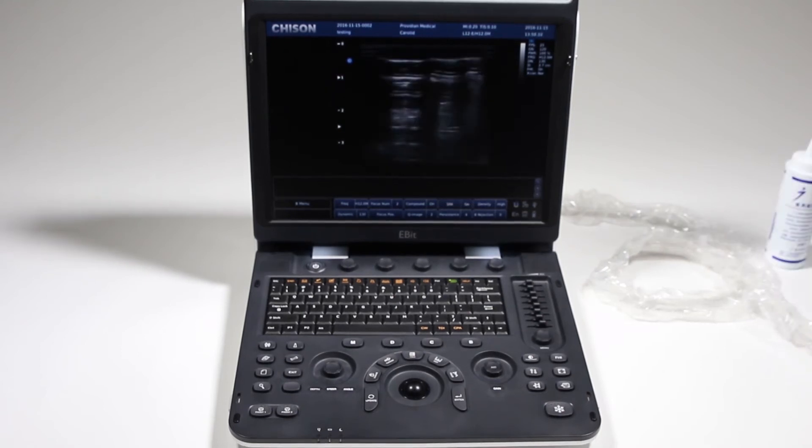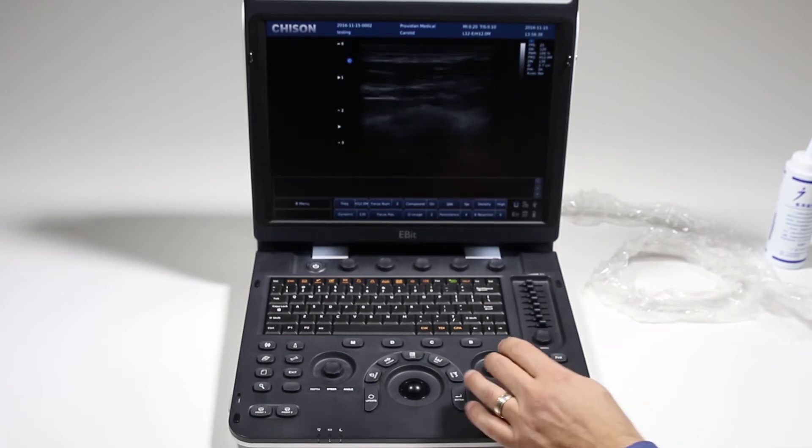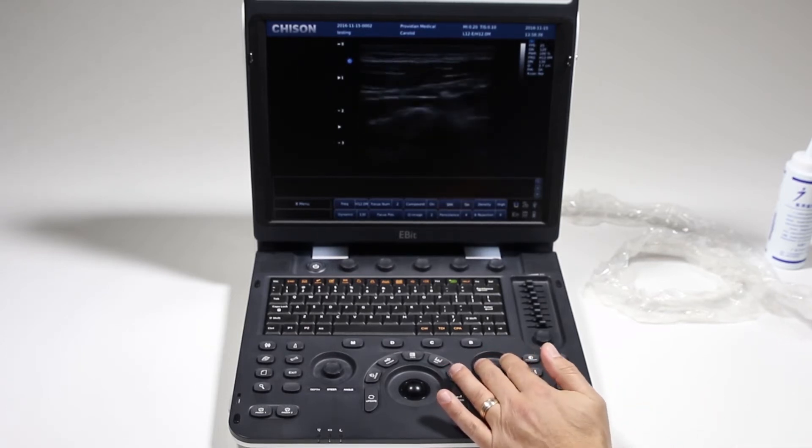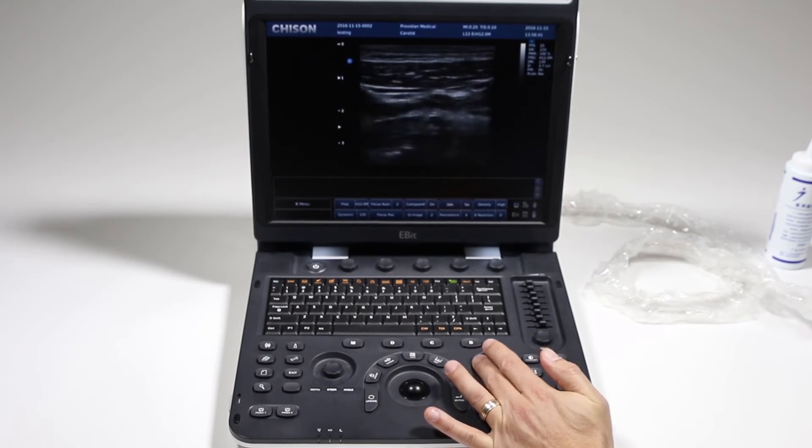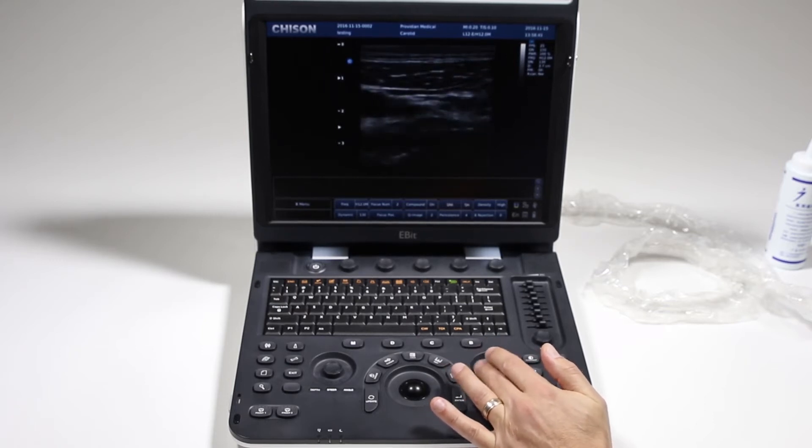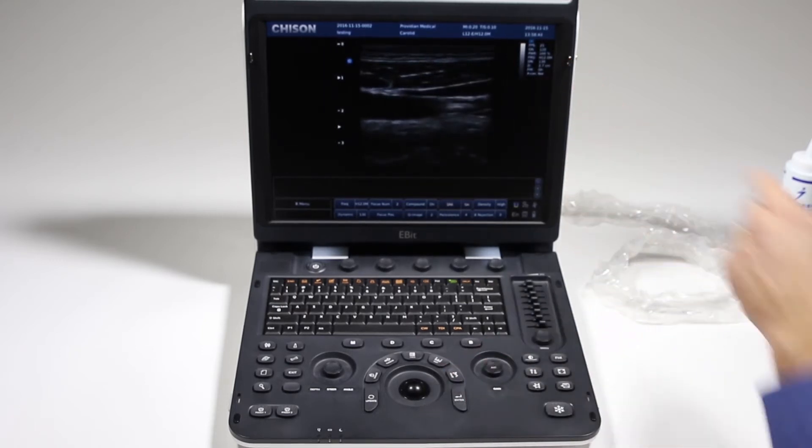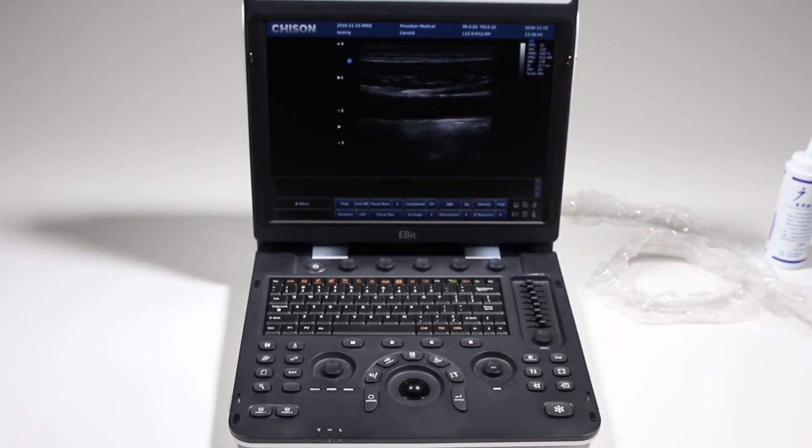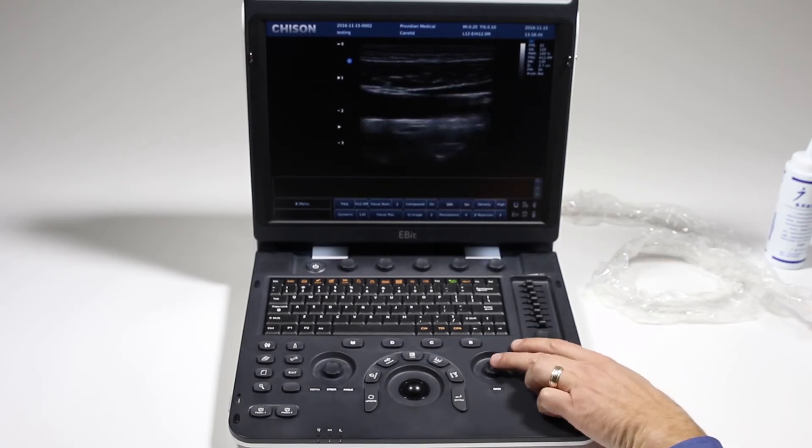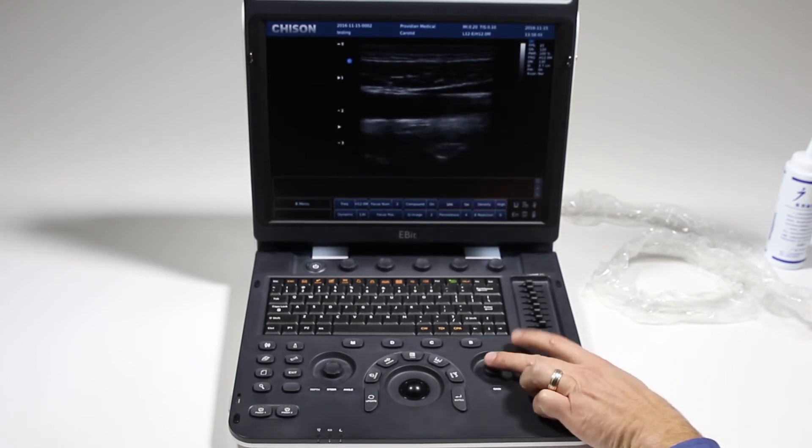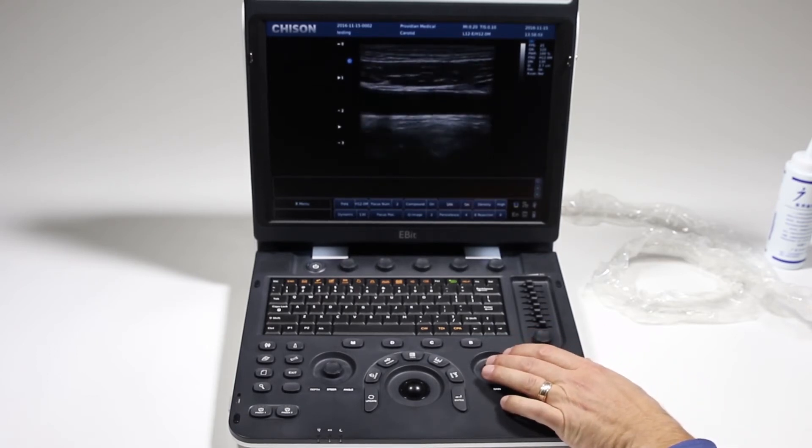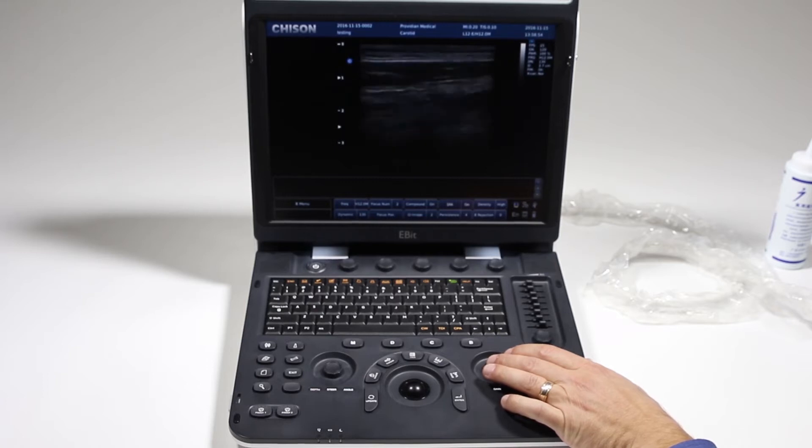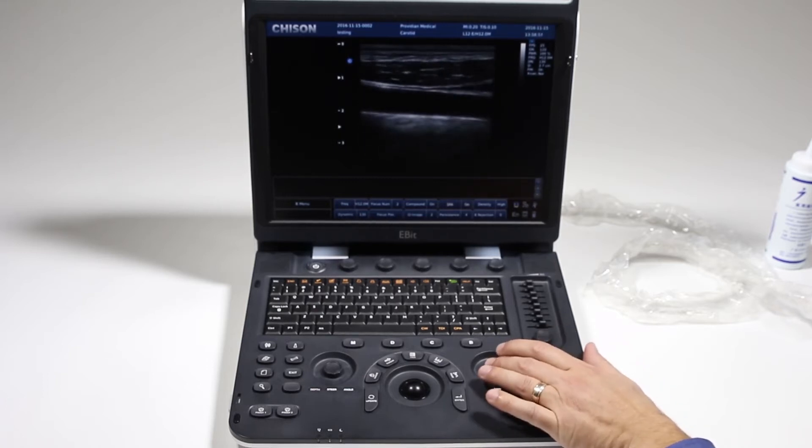When we want to start scanning, we've selected our preset and a lot of times the first thing you'll go to is your gain, where you can just twist this here and increase or decrease your gain. You'll see your gain value up here. We also have automatic image optimization. Just by pushing that down, it will try and optimize your image based on what it sees.